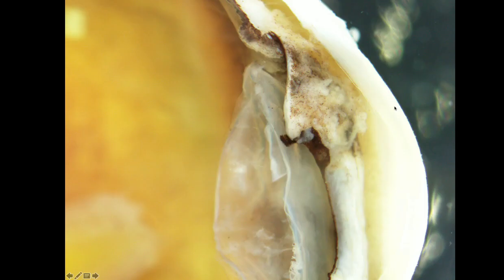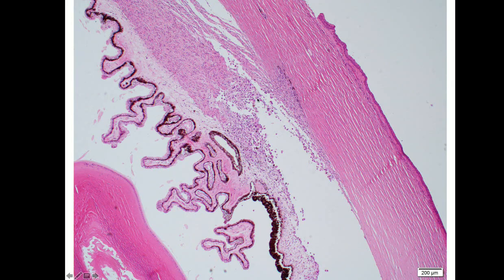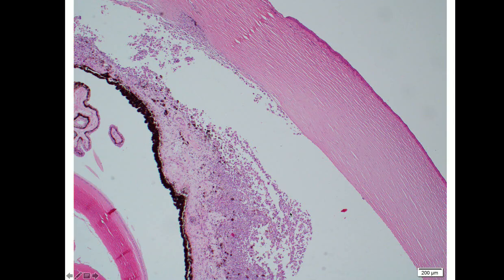So it's quite subtle, but there it is, a thickened ciliary body, and the pars plana is looking quite abnormal. That's what it looks like on a slide for us under the microscope. That's the H&E stain. And on higher power, we have the lens here. This is the pars plicata of the ciliary body, ciliary muscle. So we've got anterior ciliary body, there's tumour cells going into the meshwork. That's cornea and iris. And on higher power again, you can see it's coming across more onto the iris here.